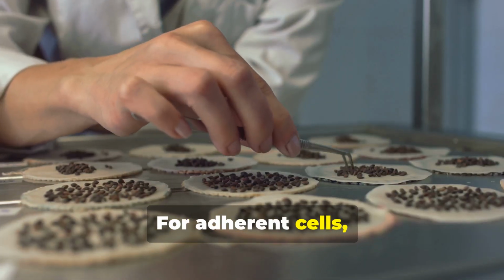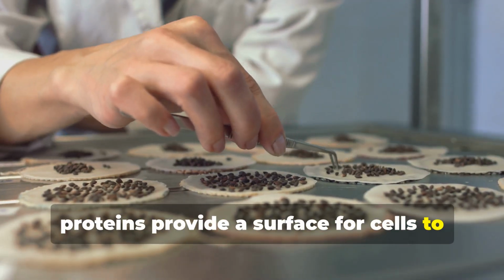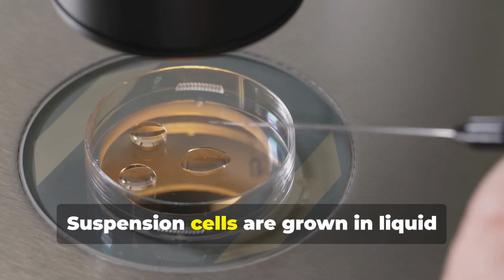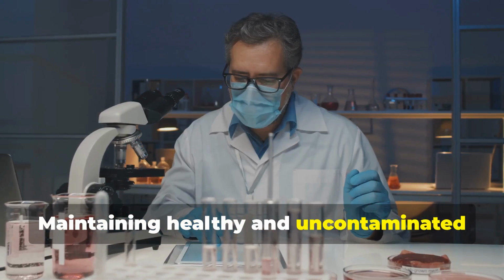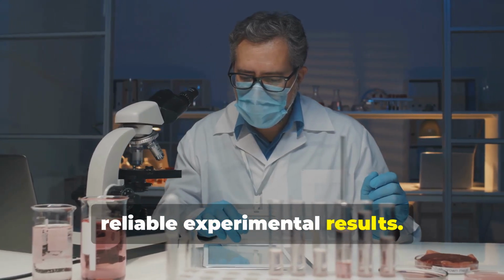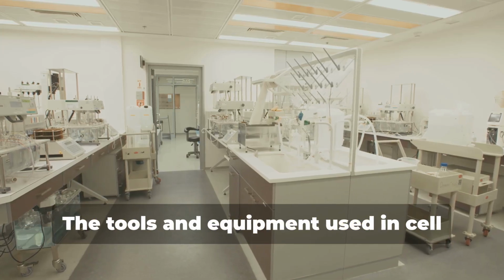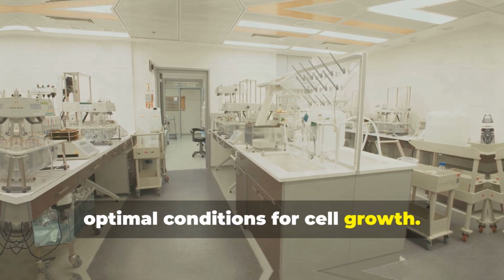For adherent cells, coated dishes with extracellular matrix proteins provide a surface for cells to attach and spread. Suspension cells are grown in liquid media within flasks. Maintaining healthy and uncontaminated cell cultures is critical for obtaining reliable experimental results. The tools and equipment used in cell culture play a vital role in creating the optimal conditions for cell growth.